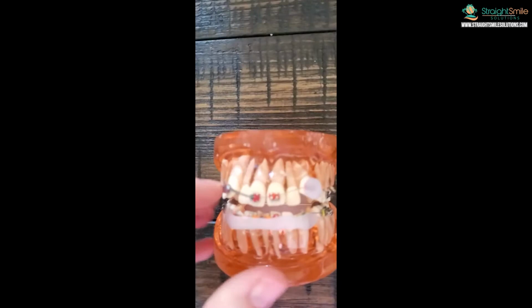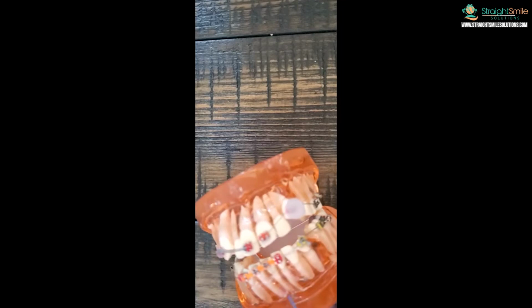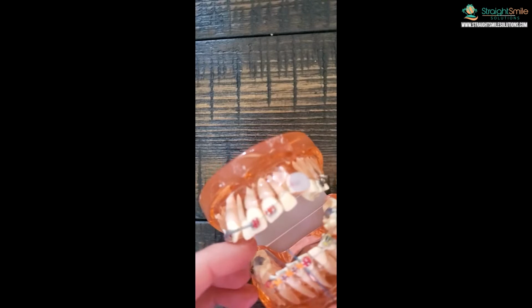Let me get this wax off. Go away, wax. I'm going to show everyone how to do it. Okay. So usually I go from gum side to the top of the tooth side and go under the wire. Okay. And then I hold on to one end and pull the blue part off. And now I'm under the wire. Can you see that? See, I can actually lift this up.